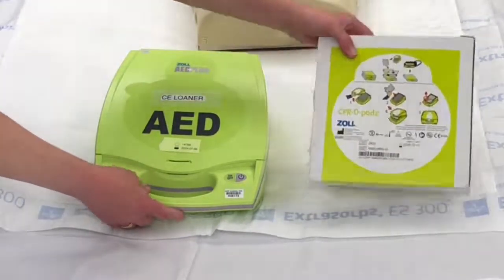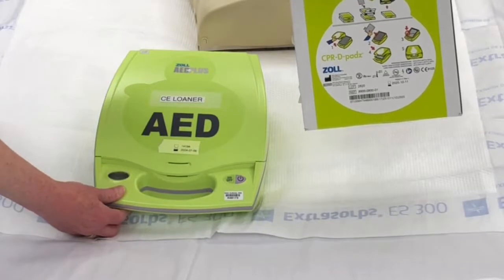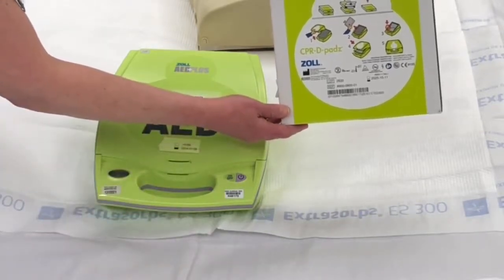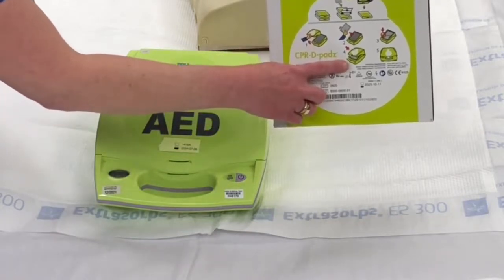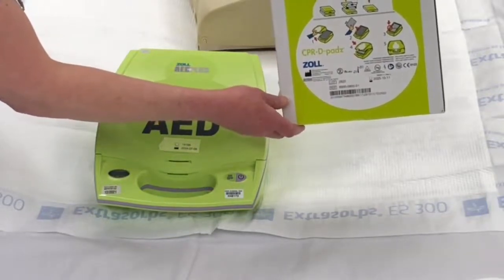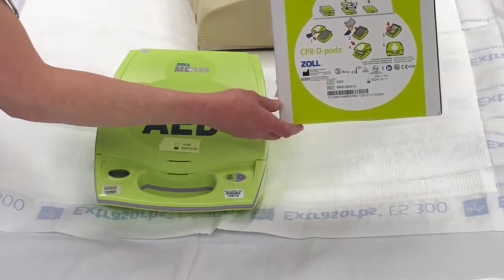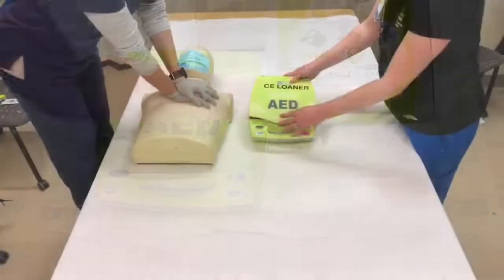And we may have a backup pad at the bedside, which is either adult or pediatric. This is a sample backup adult pad, and you can see that it has a picture of the green AED Plus. And this is not the pad for the Zoll M-Series manual defibrillator. If you keep backup pads at the bedside, please make sure that the expiration date is current.